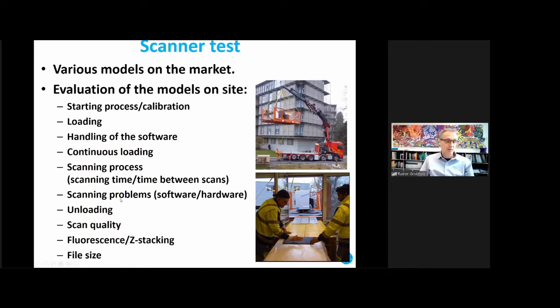So what about problems in tissue recognition or in the focus? What about the unloading and the fluorescence and Z-stacking and the file size? And you see all this leads you to a longer scanning period than just the actual scanning process.